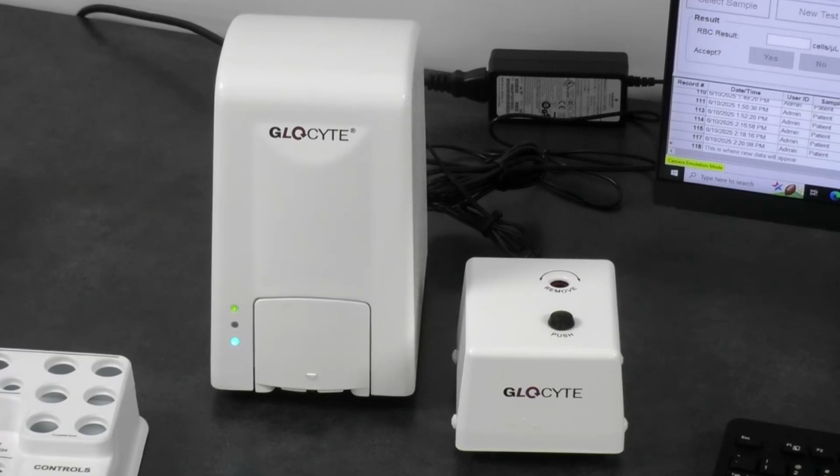Michelle, is there any expansion to other fluid types? Currently, we're exploring everything, so the more feedback we get, the better. But at this specific moment, we can only do CSF fluid.